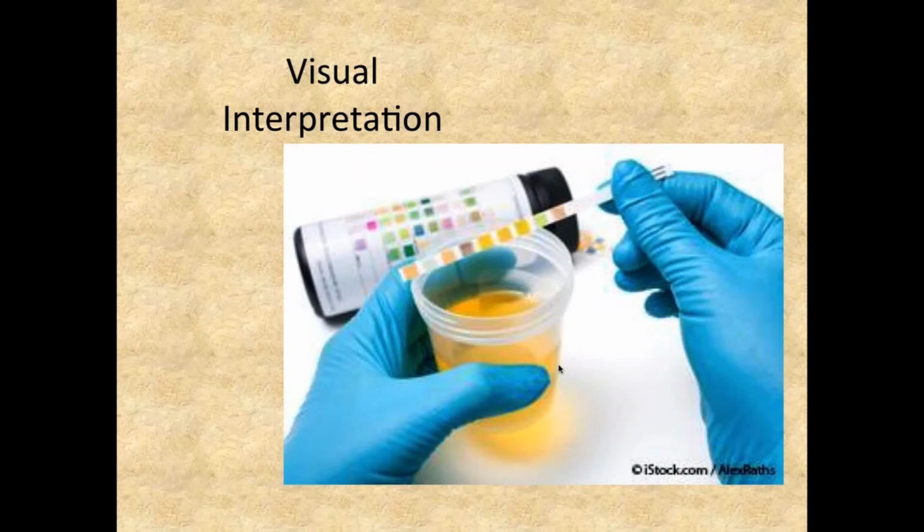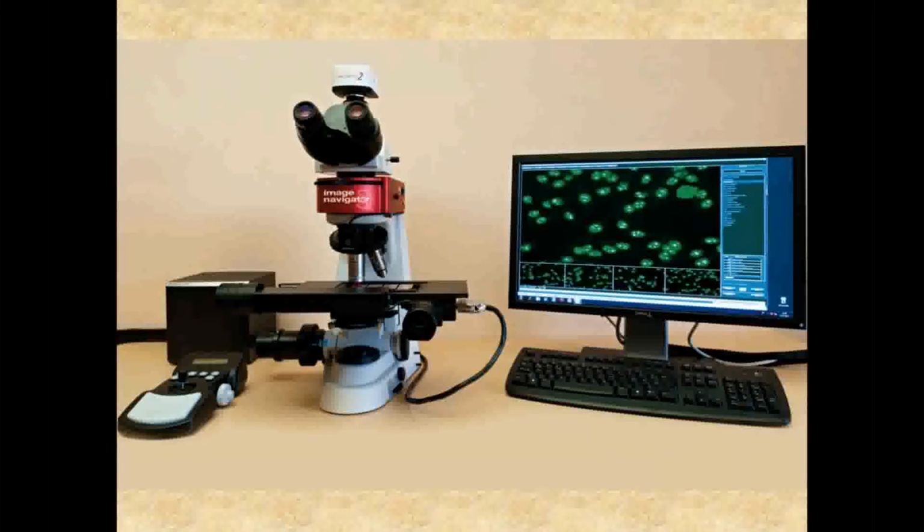But it is very labor intensive, and it takes a lot of time, and traditionally it's done in a dark room or closet someplace where the microscope is set up so that we can see the fluorescent reactions. Several years ago, our lab started working on an automated version of the fluorescent microscope.